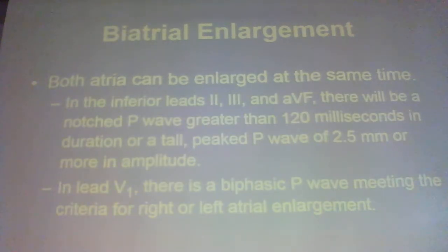Biatrial enlargement, both atria enlarged at the same time, so we get the double whammy P wave looking things. We get the biphasic P waves in some of the leads, and we get the tall pointed P waves in the other leads.